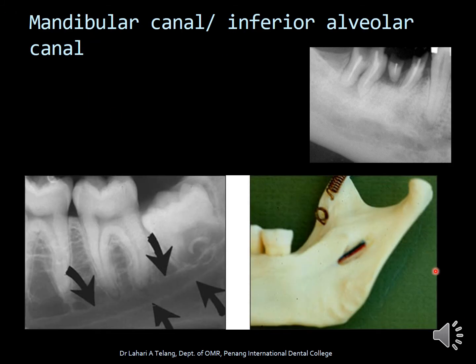The mandibular canal, also called the inferior alveolar canal, is indicated by the black arrow marks. The inferior alveolar nerve passes through this canal. It can have varied appearances but is an important landmark, and is of great significance when placing an implant in an edentulous area.